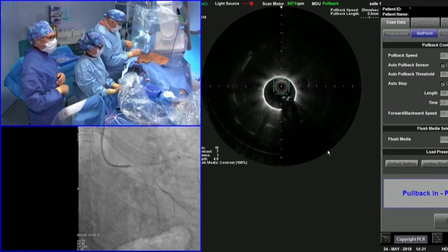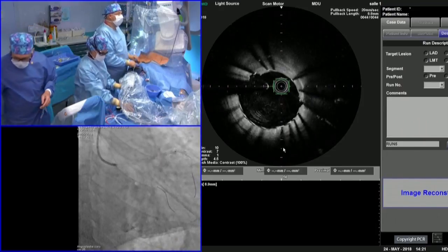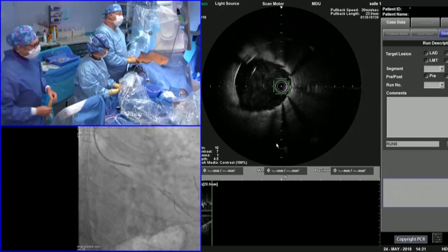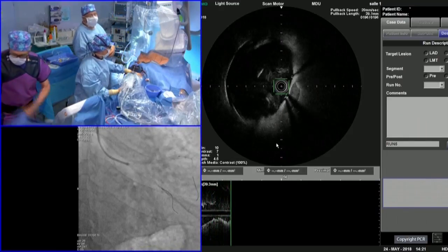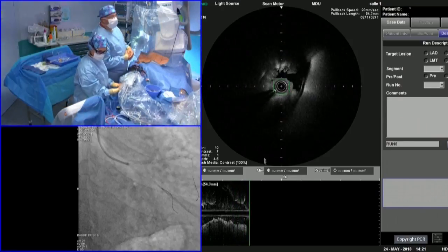Okay. So I will go to the time to react while they are looking at the images, and Bernard will do the final pot with a 5.0 balloon. Final pot and final control angiogram while they are reconstructing, and thank you for coming to the time to react.